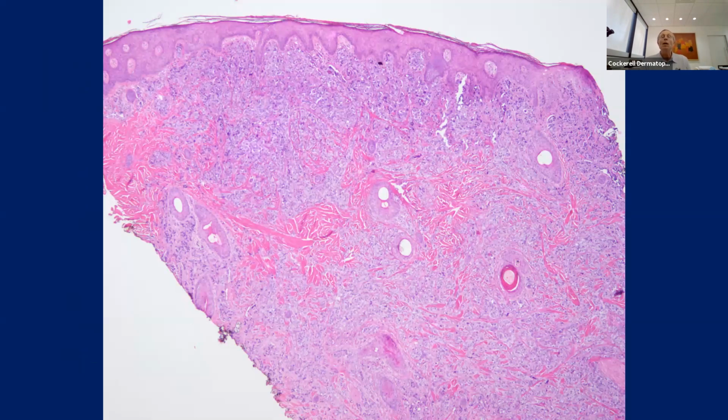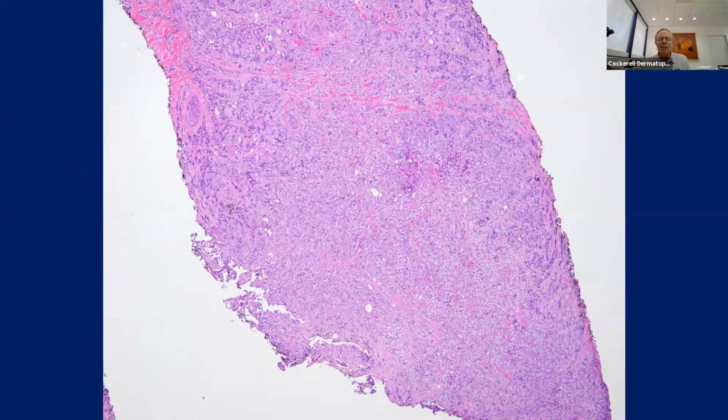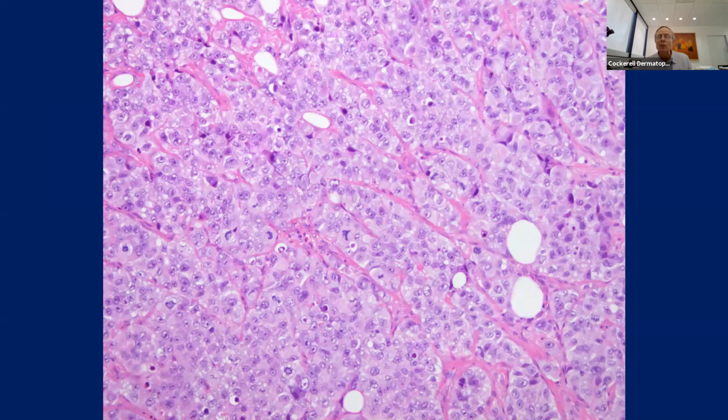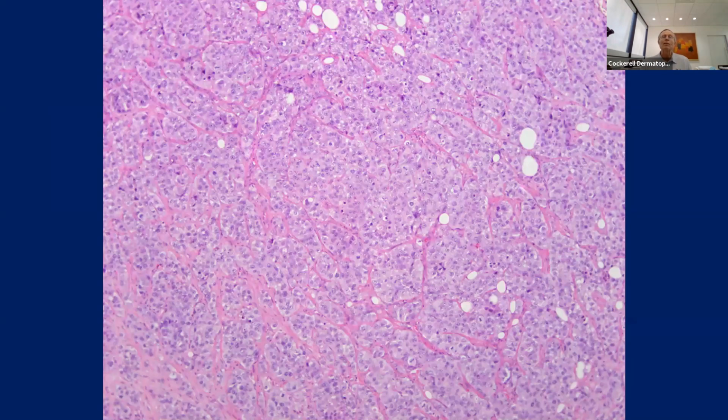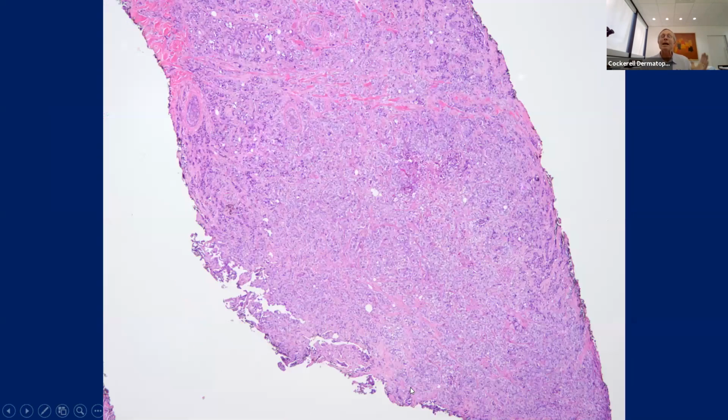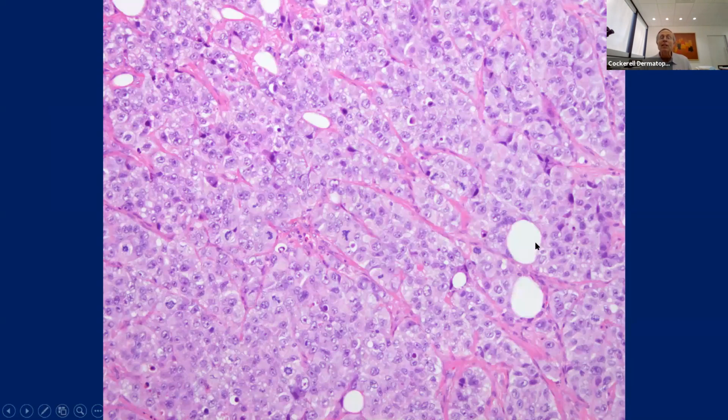Okay, punch biopsy. Inflammatory or neoplastic? Well, it's got a lot of epithelial cells here, things that are epithelioid. It's mostly in the dermis. It's very diffuse. They did a punch in the middle of this thing. That didn't look good. So whenever we see something like that, we get very concerned about the possibility of malignancy. It goes all the way to the base. Very atypical cells here, epithelial differentiation, a lot of mitotic figures. So, malignant epithelial neoplasm. Going back to low magnification, notice that it's involving mostly the dermis, not the epidermis.